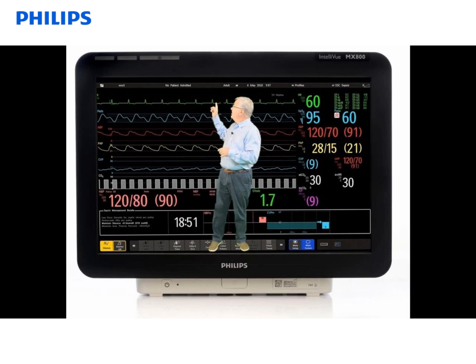The big bar next to the first two alarm lamps with the bell and a line through it indicates that your alarms are turned off or paused. If they're paused, you will not get any alarm conditions, including red arrhythmia alarms, so that's something you need to be aware of.